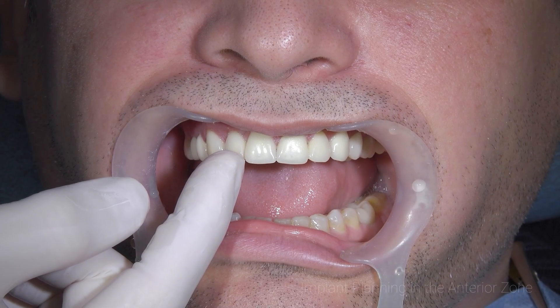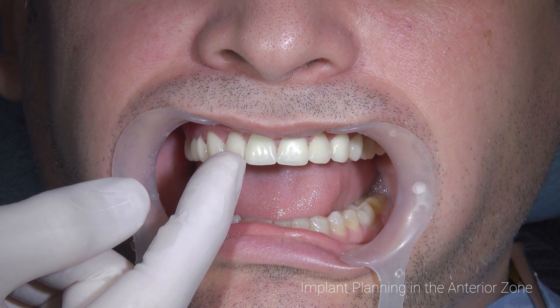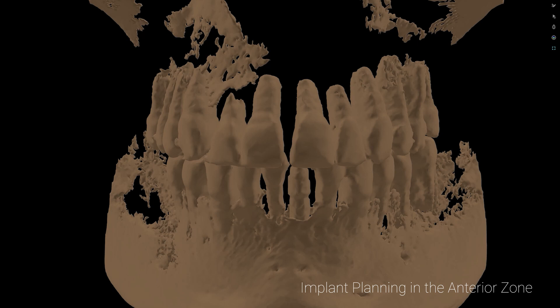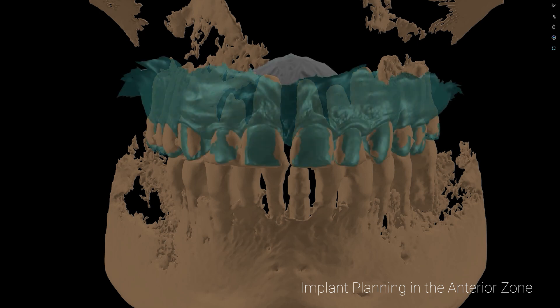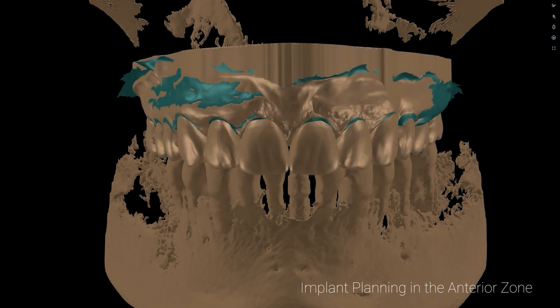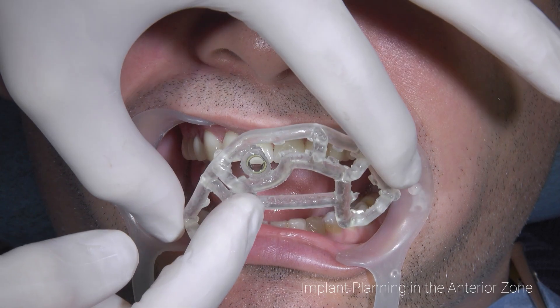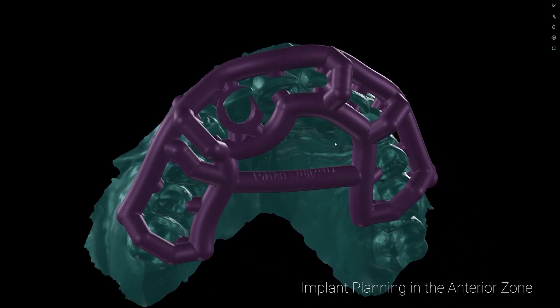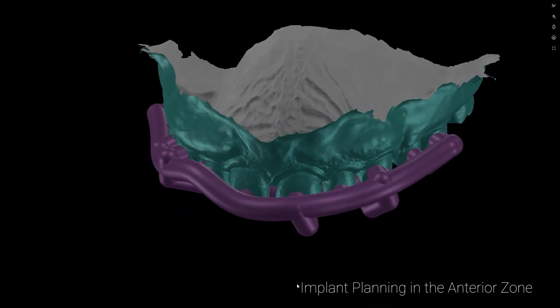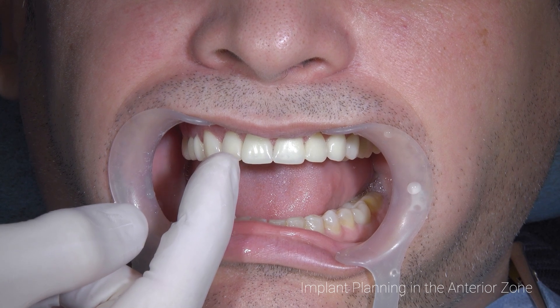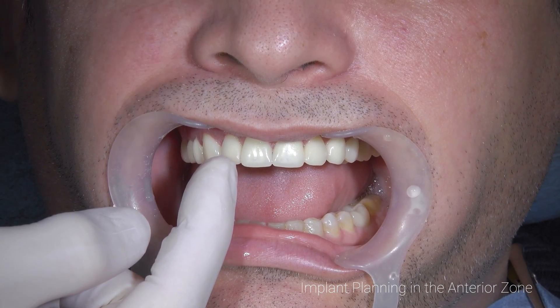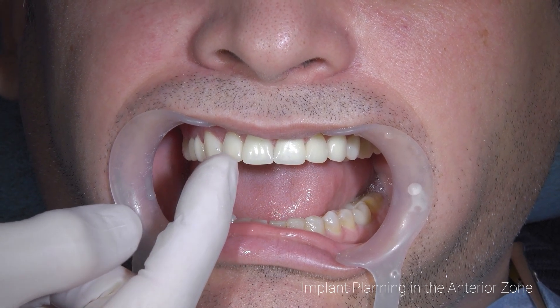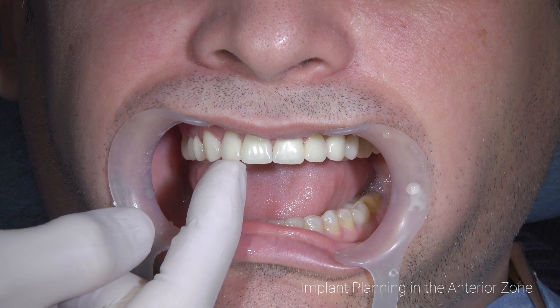I got inside the software — the CBCT from yesterday, the scan done on Thursday — and projected the STLs to do this. Inside the software, with the three files, I can plan my implant according to this situation. We have an implant to be screw-retained.